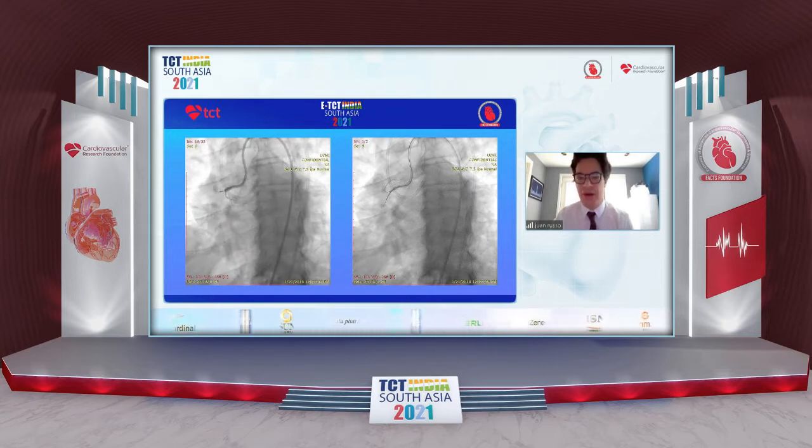And then we were able to identify where the proximal cap was, and it seemed like a pretty viable antegrade wire escalation strategy. Then through a second wire, we delivered a Turnpike Spiral and used a Pilot 200, which was initially unsuccessful. We escalated to a Gaia Third, which allowed us to penetrate the proximal cap of the CTO.